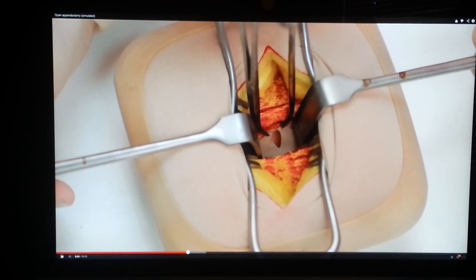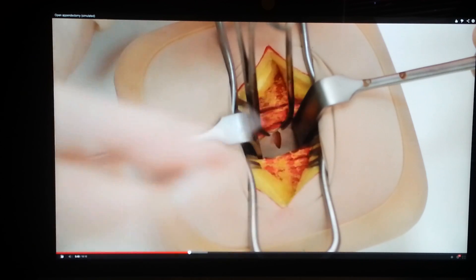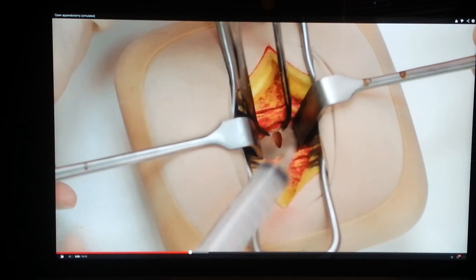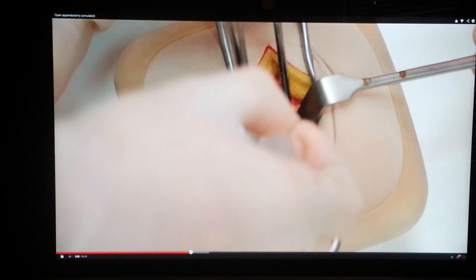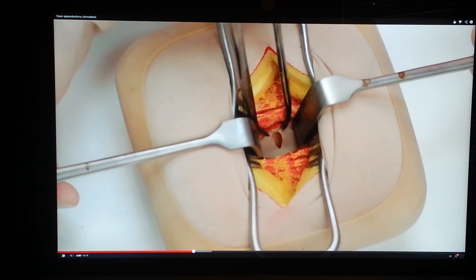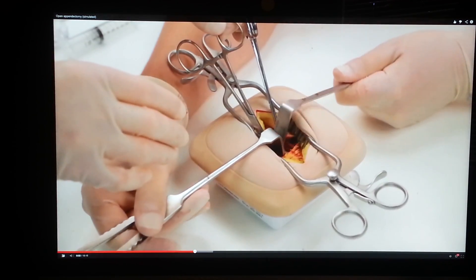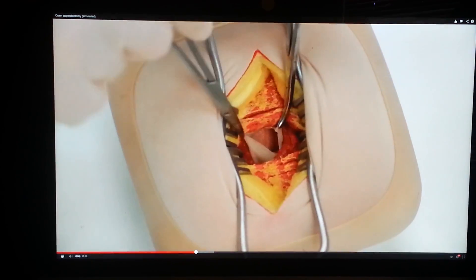If there is free fluid or pus, take a swab or alternatively collect a sample of fluid using a syringe. Look for any bile-stained fluid which may indicate a perforated peptic ulcer. Identify the cecum via the taeniae coli and follow these to the base of the appendix.